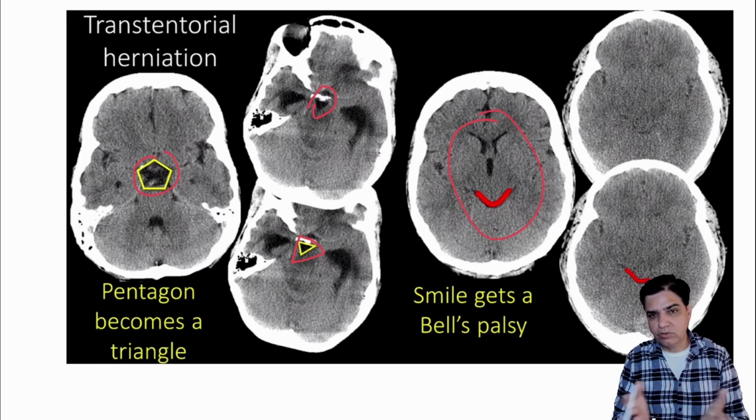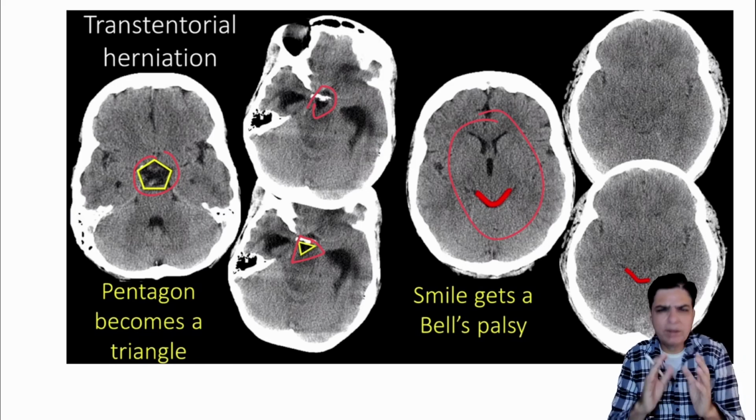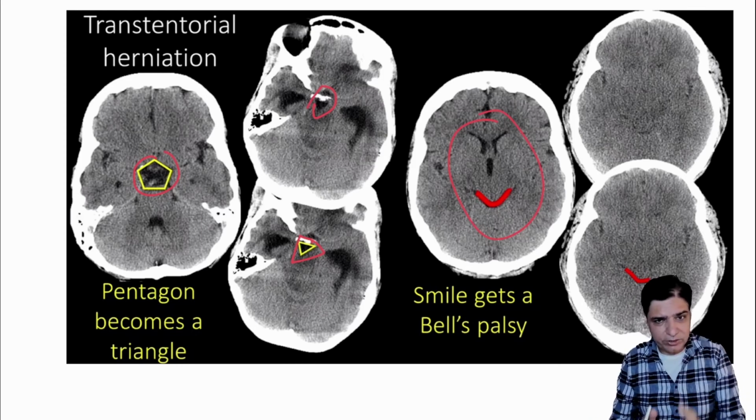So that can cause bleeds, that can cause stroke, that can cause infarct. So a pediatrician will be more interested from that particular point of angle. But nevertheless, the principles remain the same. Whether you are an adult physician or a pediatrician, you still need to focus on these things.